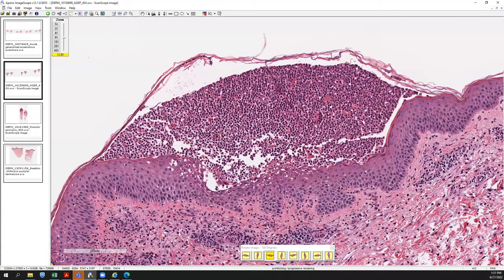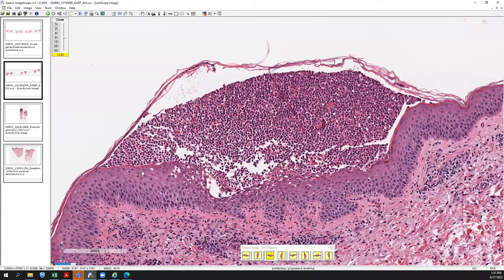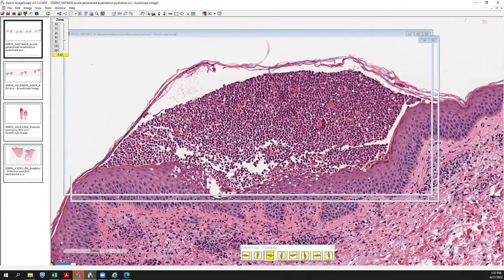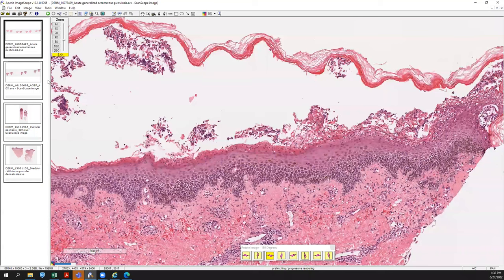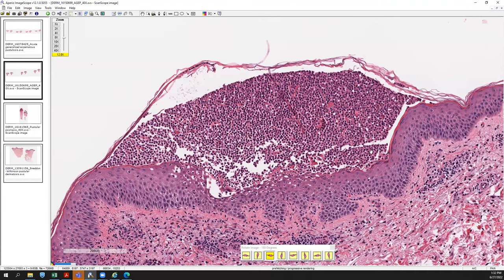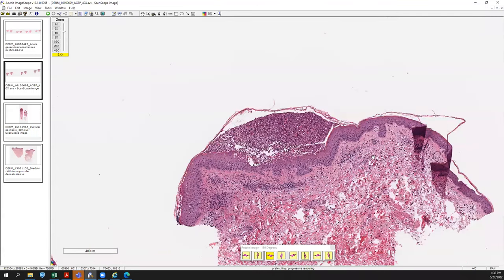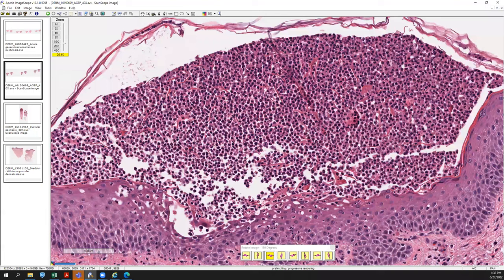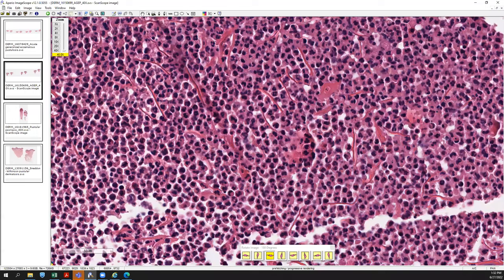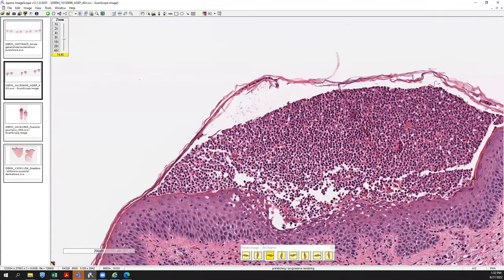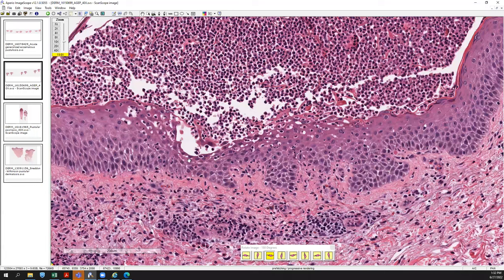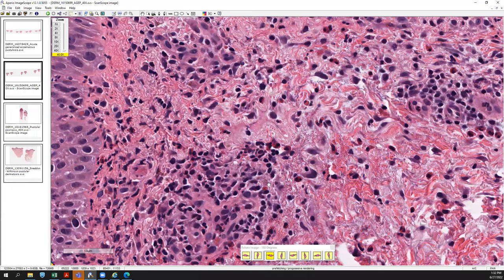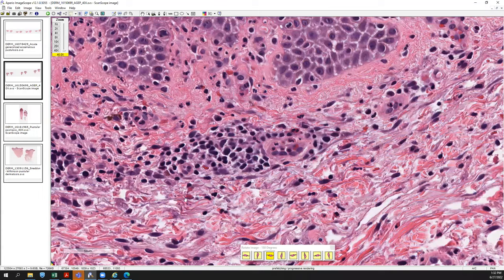Here's another more classic image for AGEP — a subcorneal neutrophilic pustule, even smaller than the previous example. The earlier pustules had already formed into a larger bulla; here it's a small pustule, probably less than two millimeters wide. Within this infiltrate you can find an ubiquitous amount of neutrophils and eosinophils. Given this circumscribed subcorneal pustule, the spongiosis, and the perivascular inflammation with abundant eosinophils, this is very characteristic of AGEP.